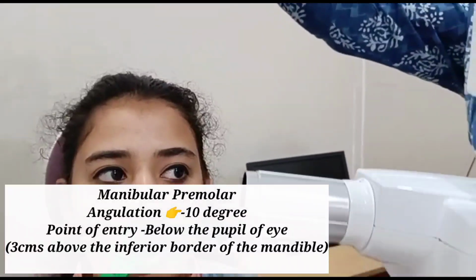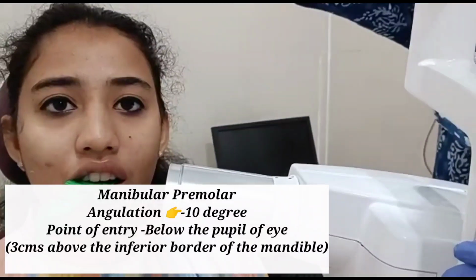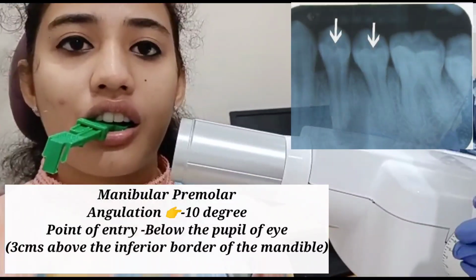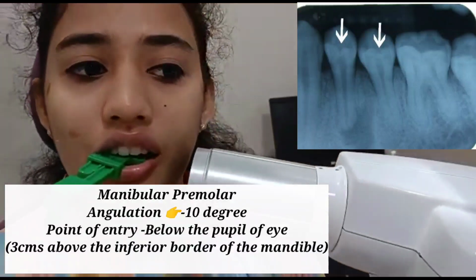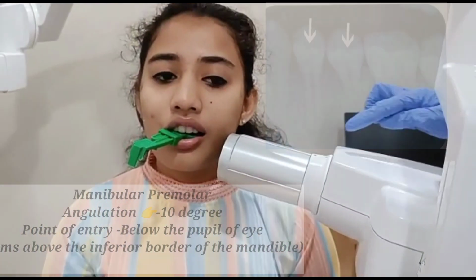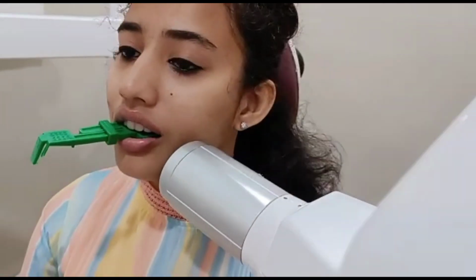So this is how we direct the point of entry for the mandibular premolar projection. You can see here where I have directed the point of entry, coinciding below the pupil of the eye. We move on to the mandibular molar projection.